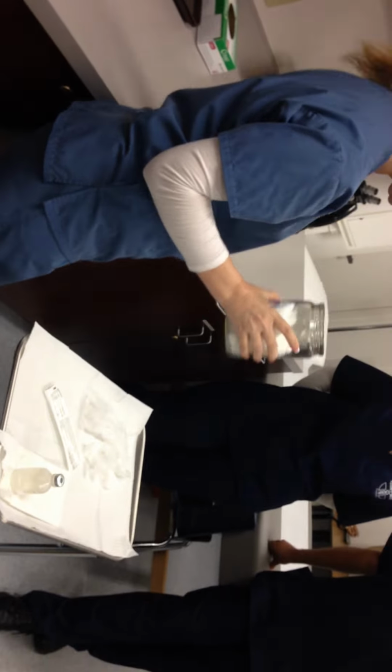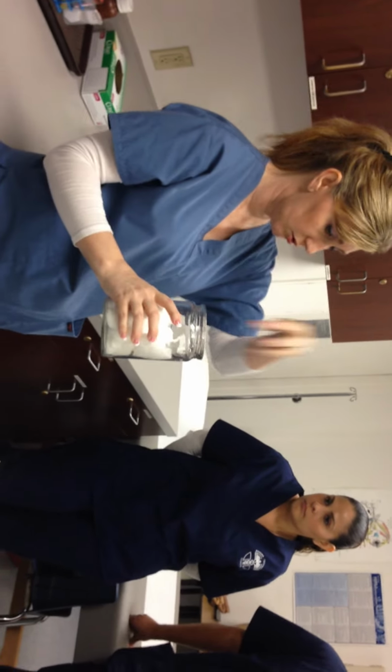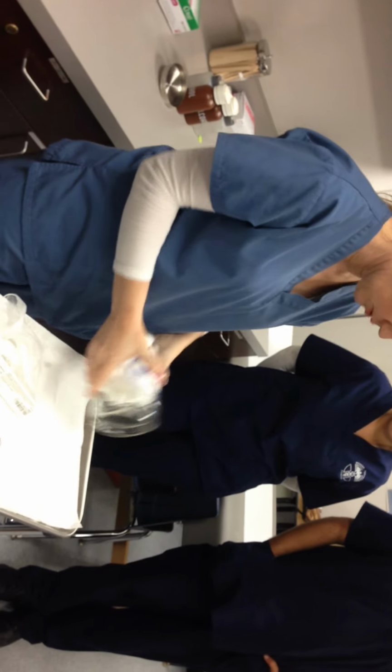Okay. We also need our cotton balls. Here we go. Sometimes there's some over there too. And you're not going to reach in here and grab these cotton balls. Even though I just washed my hands, we still don't want to reach in there. So what you're going to do is you're going to put them on your tray like this.